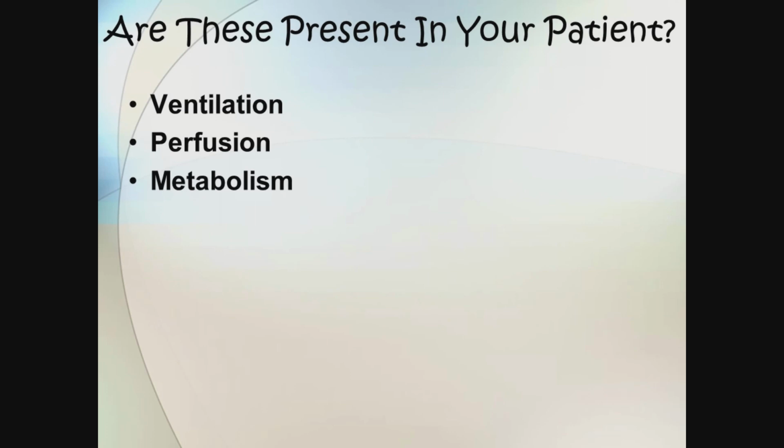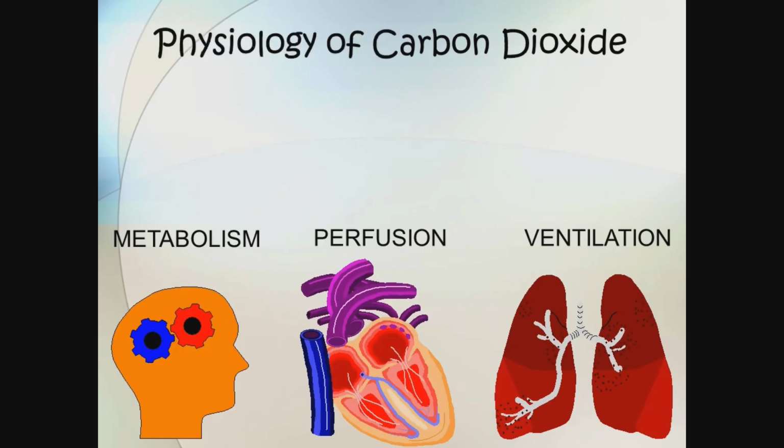But if your patient has ventilation, which I'm hoping they do, otherwise we have to talk. If your patient is being perfused, or if they have metabolic activity, we should be monitoring their end-tidal CO2 level, because all three of them play into the process. We normally just think of the one on the right, but in reality, CO2 is very perfusion dependent, and it's very dependent upon metabolic processes also. If you are hypometabolic, is that a word I want to use? If your metabolic rate is reduced, your end-tidal CO2 is going to be reduced also.